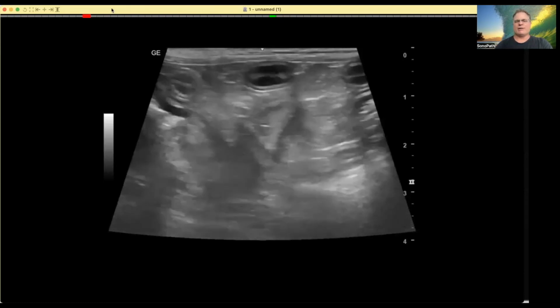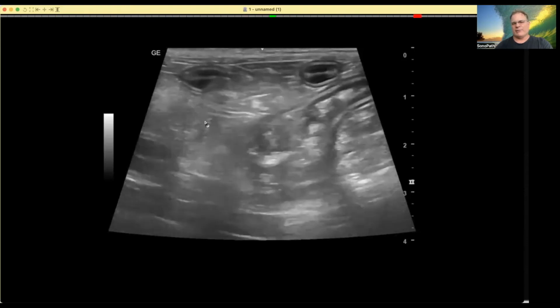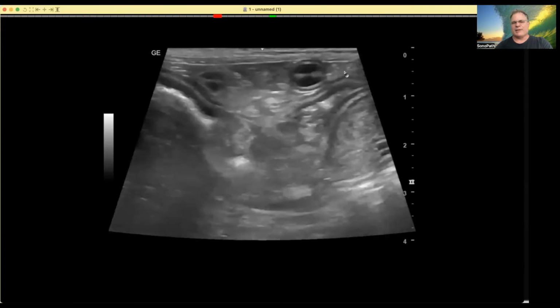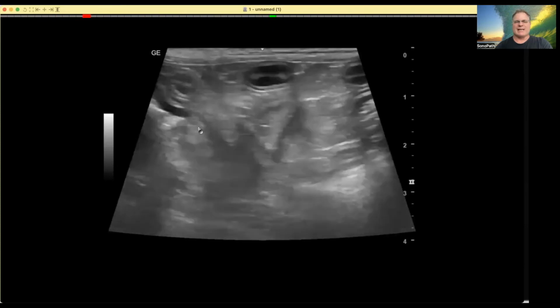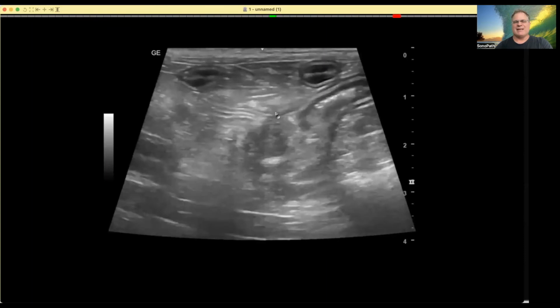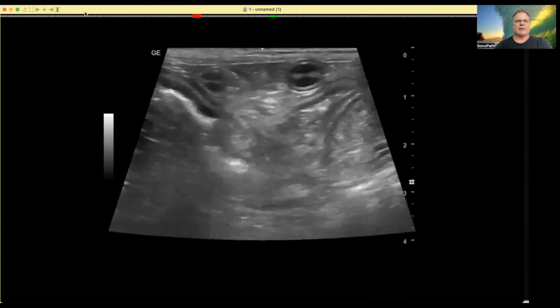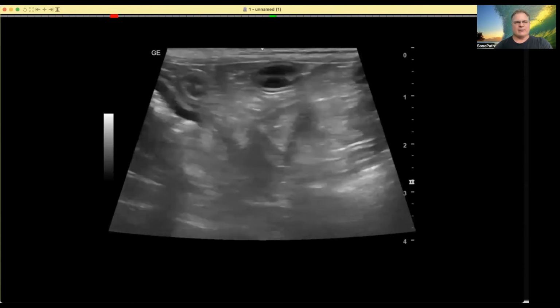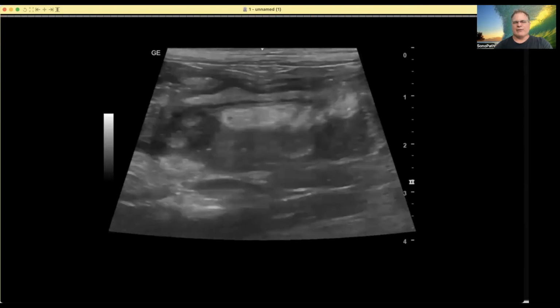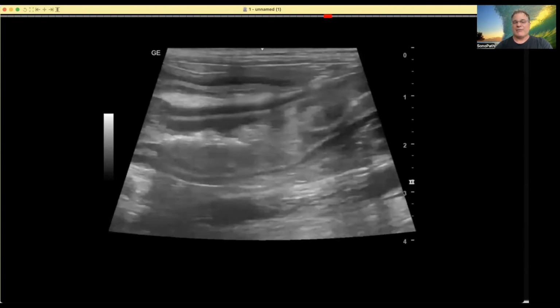So this is another interesting video. We have an obstructive pattern, right? We have this pathological bowel, we have this stasis of ingesta here. It's all kind of bound up and not moving. And then we have the empty small bowel. So dilated upper GI followed by empty small bowel creates an obstructive pattern. To me, this is a surgical case, just to get this bowel out of here and biopsy and culture the lymph nodes as well. That's what I would do with this one, because this bowel doesn't belong there. It is bad. It is ugly. It is pathological. Is it neoplastic?